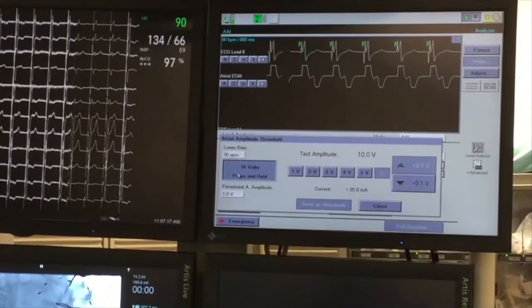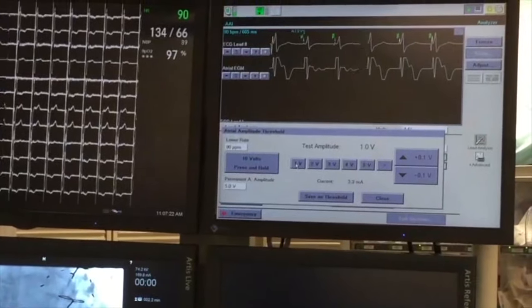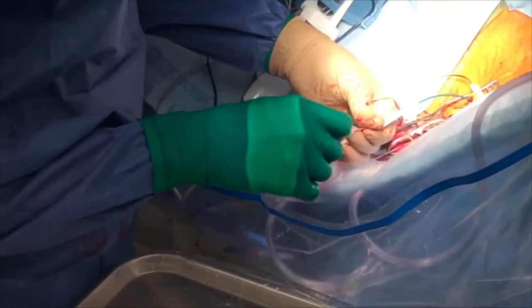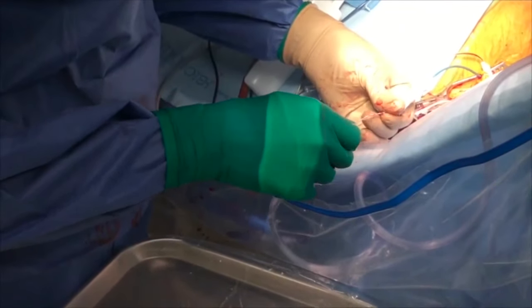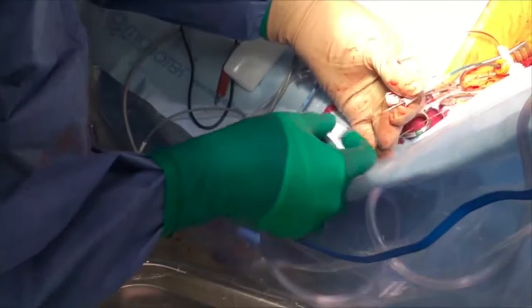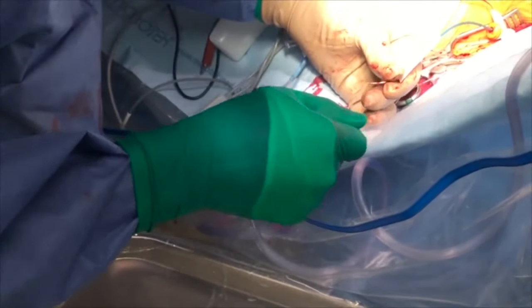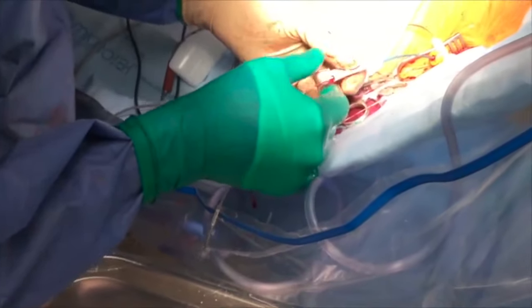At this point, it is very important to check pacing thresholds and for his-bundle recruitment in both unipolar and bipolar configurations. In this case, the local ventricular EGMs clearly show excellent local ventricular injury, thereby confirming that the lead tip is well anchored within the myocardium. At this point, pacing is then performed at varying outputs. In this case, there is non-selective his-bundle capture. The QRS morphology is wider than the intrinsic QRS, with the stimulus to QRS that is shorter than the intrinsic HV interval. The output is then reduced to see if there is further QRS widening, confirming his-bundle capture.